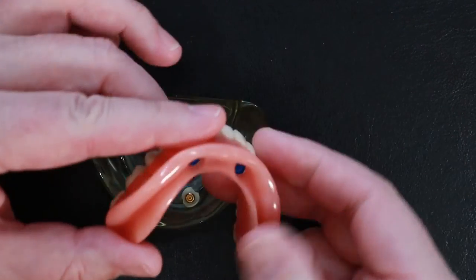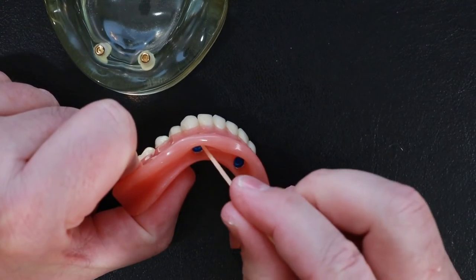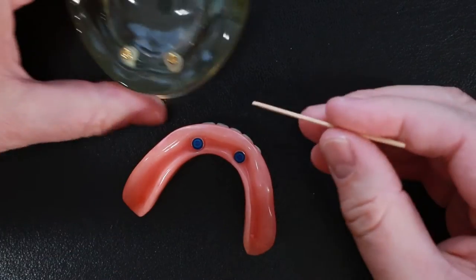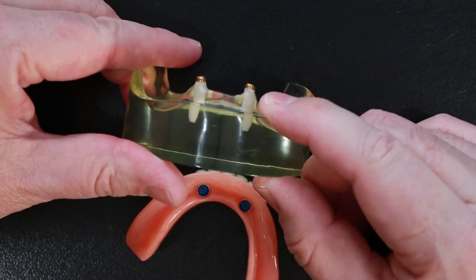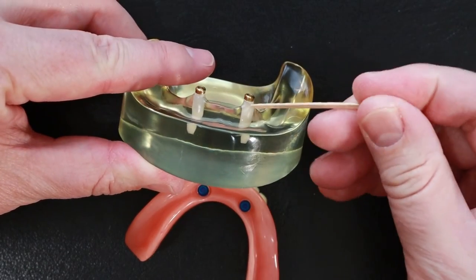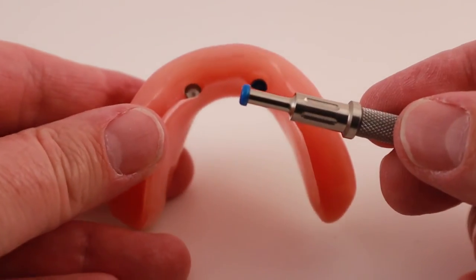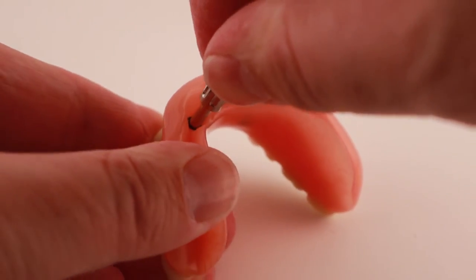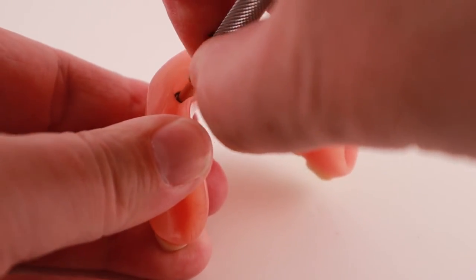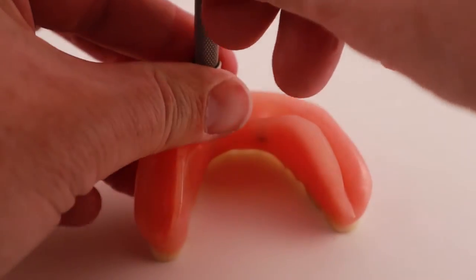The first and most common issue is the plastic snaps not holding the denture securely. As I already mentioned, make sure there's no food or plaque stuck inside the snap and make sure the implant posts are clean. Posts have a tiny lip on them which the snap snaps onto, so it doesn't take much for them not to snap in place. If that doesn't help, then the next step is to have your dentist replace the snap with a new one of the same strength or a stronger one. Initially, I'll use the weakest strength snaps and only switch to stronger snaps if it's needed. Since the snaps are made out of plastic, they will wear and need to be replaced from time to time.